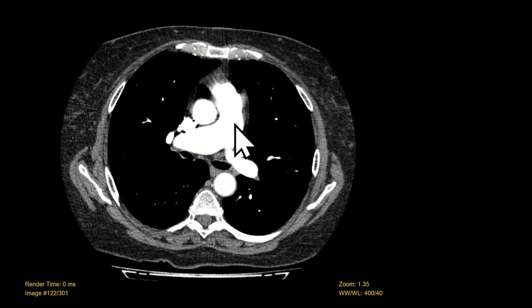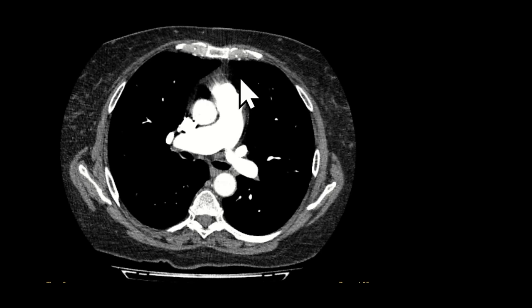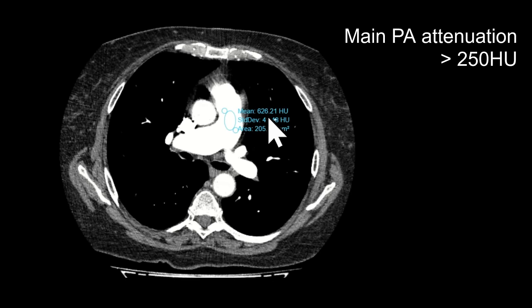When reading these cases, first we want to make sure that the opacification of the pulmonary arteries is adequate. To do this you can draw an ROI over the main pulmonary artery — this should be greater than 250 Hounsfield units or so. Here it's much higher at over 600 Hounsfield units, so that's adequate.